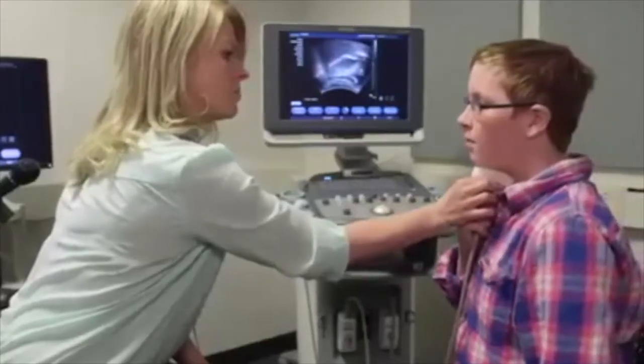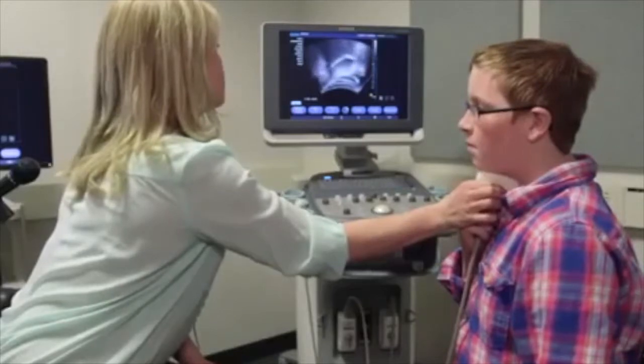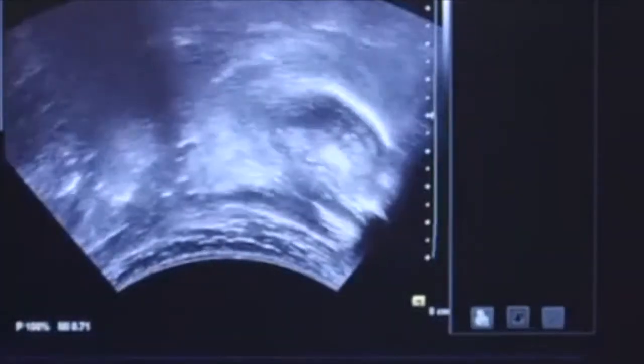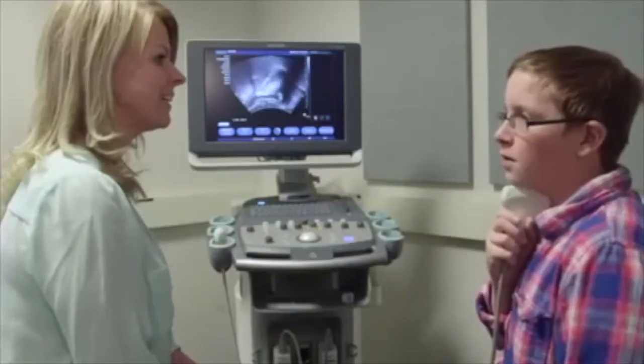To assess distorted R production, instruct the participant to imitate and sustain the R sound. Then, have the participant imitate the R sound in a number of syllables, such as ear, say ra, say re, say ru.